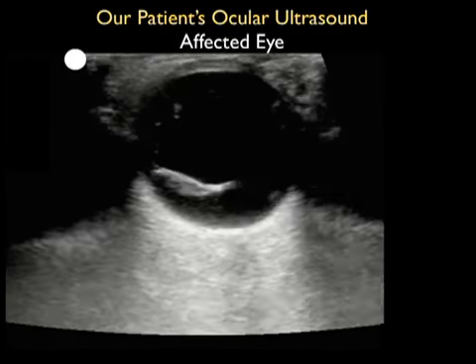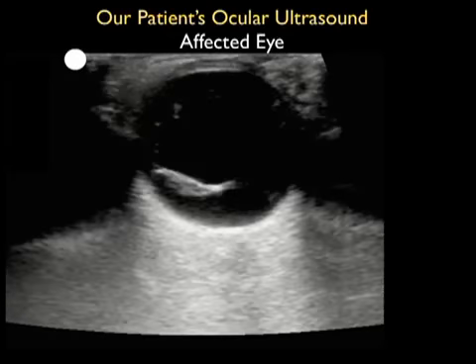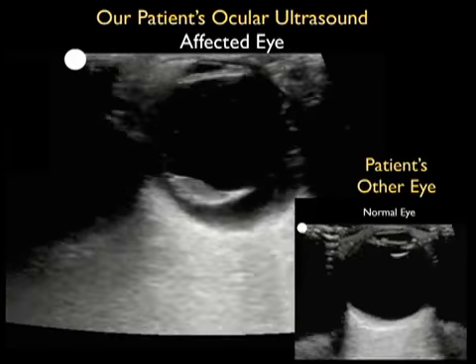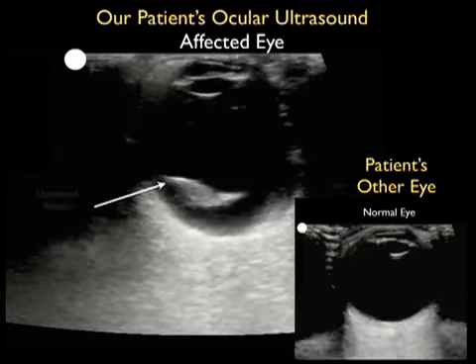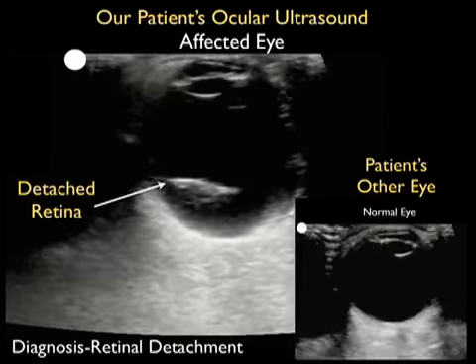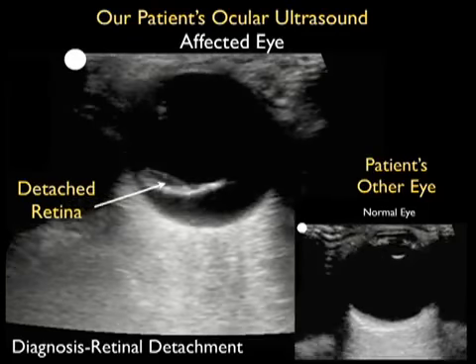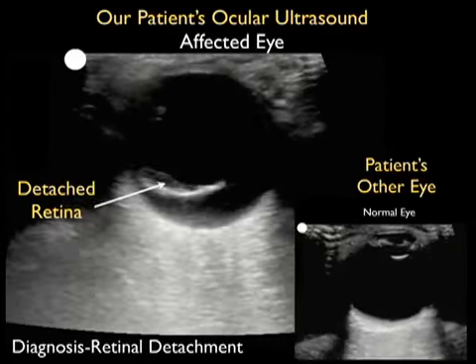Now let's return to our patient's ocular ultrasound, placing the probe in a side-to-side or transverse orientation over the affected eye. Right away we note that there's pathology within the posterior aspect of the eye, and we can see a hyperechoic or bright structure waving around in the posterior aspect of the eye that should not be there. We'll look at the patient's other eye in this small video to the right, and we note here the normal appearance of the retina tacked down to the choroid. So in the affected eye, this is actually a detached retina that's moving around as the patient looks up and down, and we have the probe positioned over the patient's eye. So right away our diagnosis within immediate orientation of the probe onto the eye is retinal detachment.